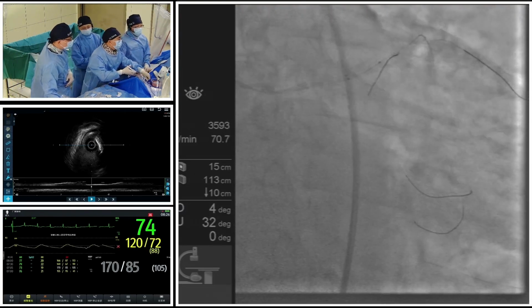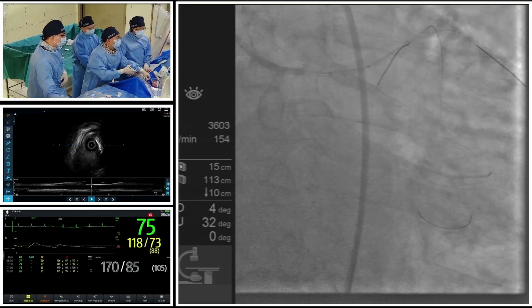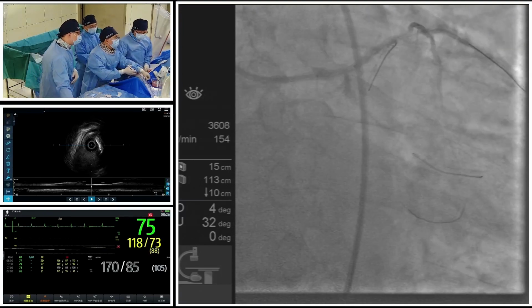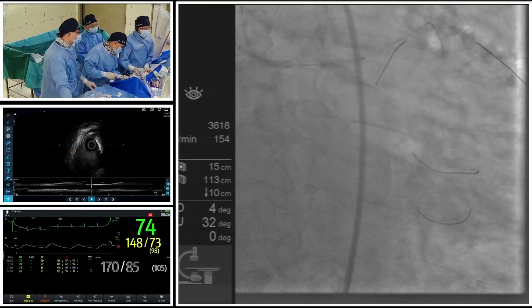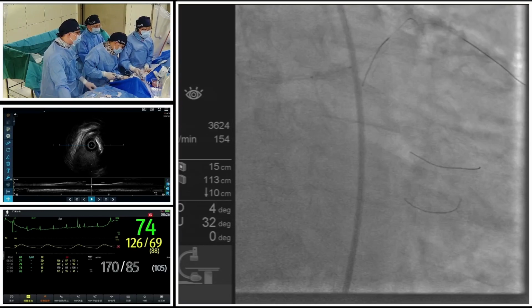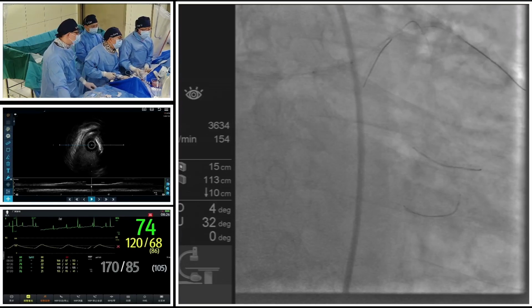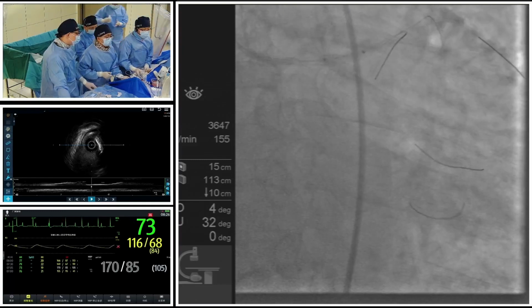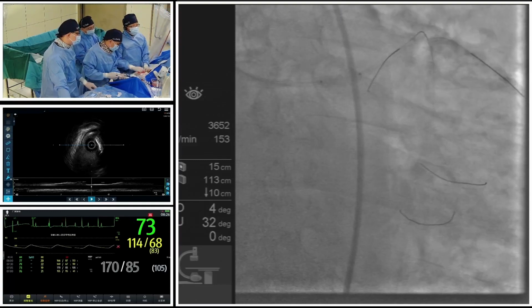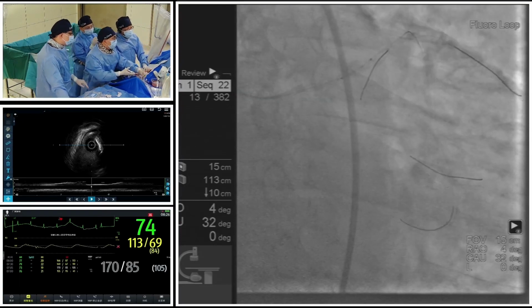First one, I think, compared to the different plaque modification systems, IVL is suitable for deep calcification and calcified nodules, especially like in this case, at the opposite side of the circumflex ostium, there is a very typical 270 degrees superficial calcification.